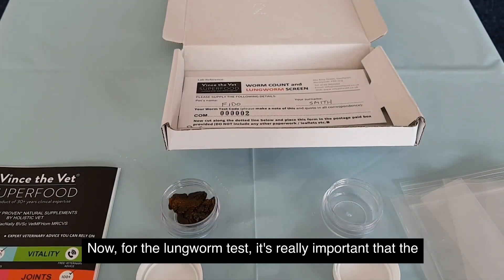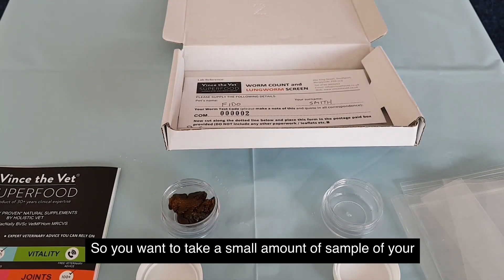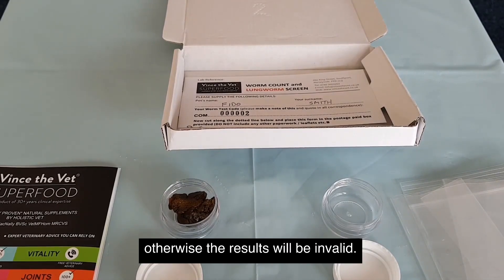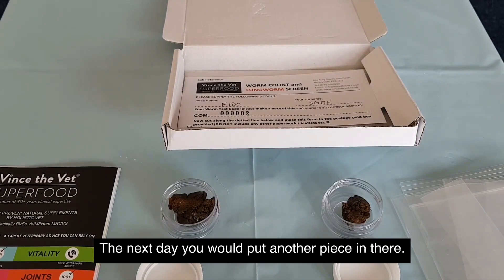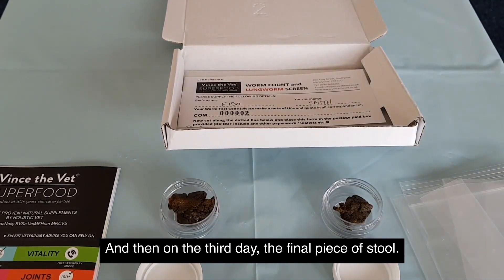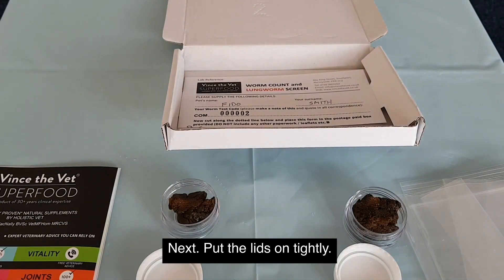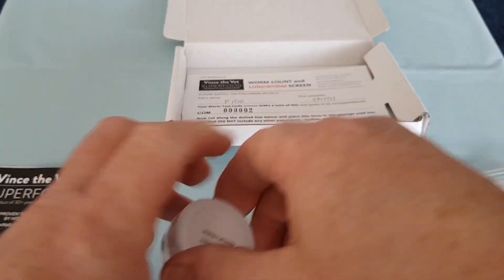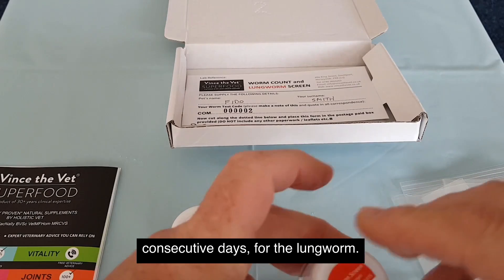For the lungworm test, it's really important that the sample contains three days' stool. You want to take a small amount of your pet's stool from three consecutive days — you can't miss a day out, otherwise the results will be invalid. So on day one, put a little bit of stool sample in. The next day, put another piece in. And then on the third day, add the final piece of stool. Next, put the lids on tightly. That's the single sample for the worm count and the combined three-day consecutive sample for the lungworm.